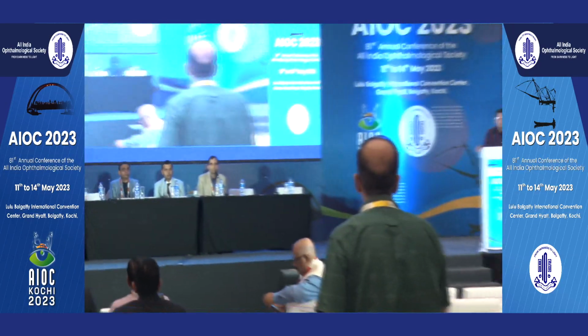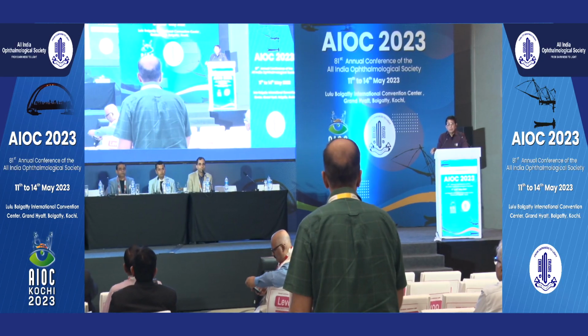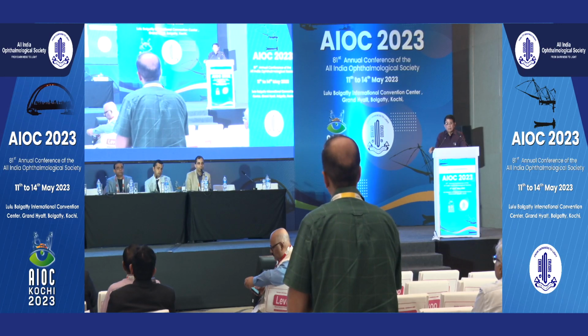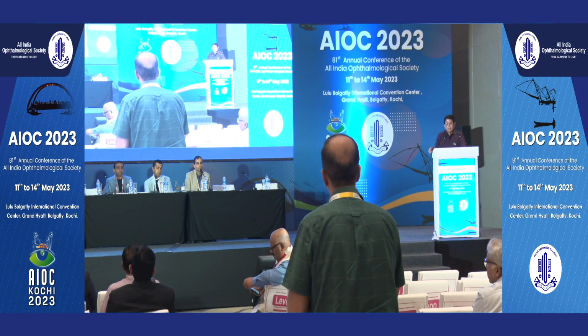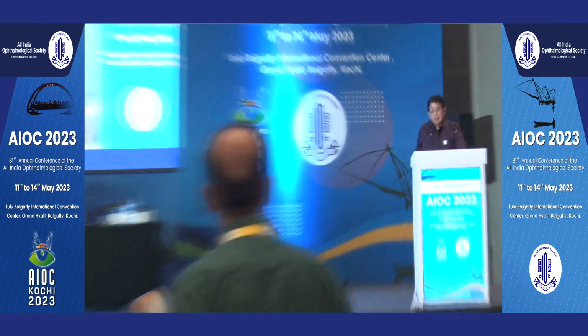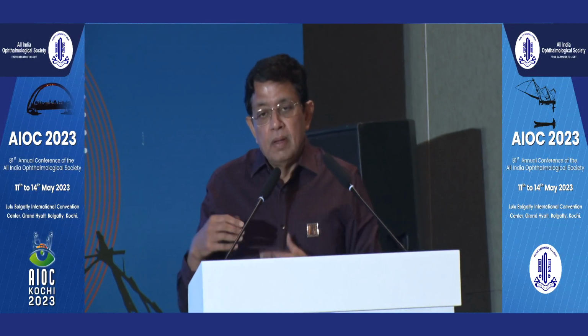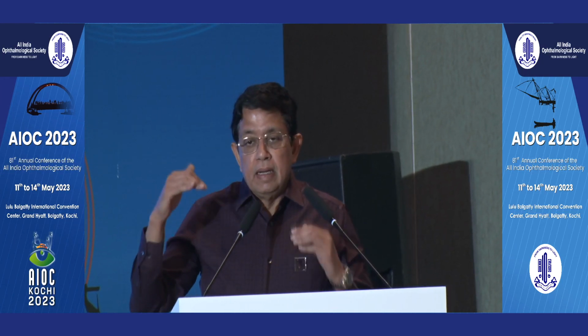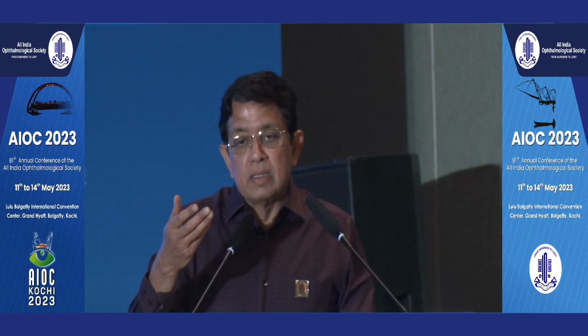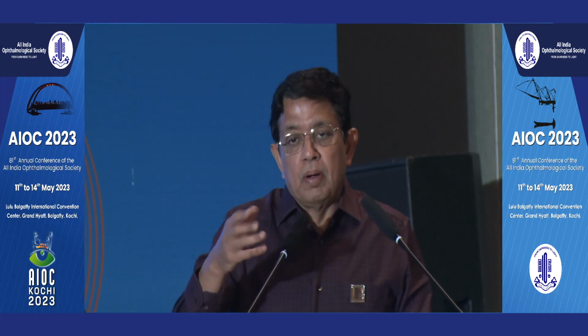Yes, please go ahead. Just one basic question. Suppose we are implanting a toric IOL and by chance in the injector it rotates, like its front side is on the back side and the back side is on the front. Is there any problem with that? No, you should definitely, especially if it's a single piece lens with not a plate haptic design, re-rotate it back, because in these lenses there is toricity on the anterior surface, and the multifocality is on the posterior surface. It's extremely important to reverse the lenses back.